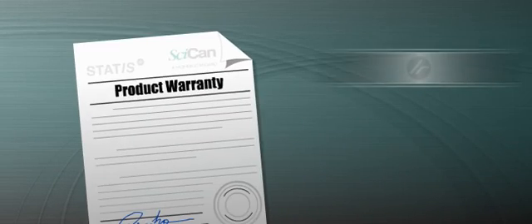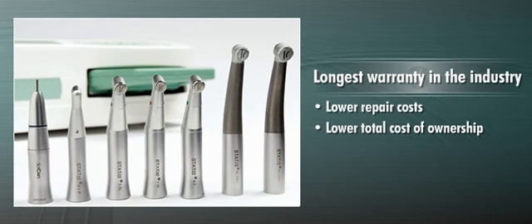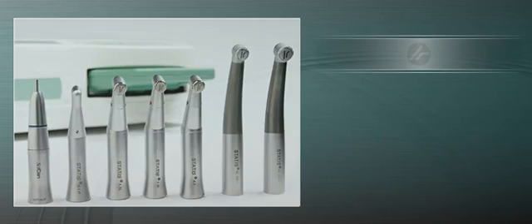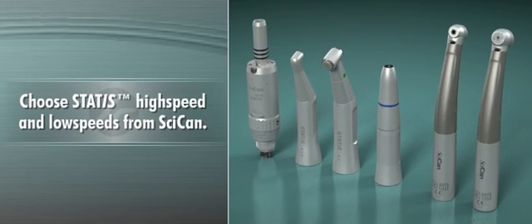And with the longest warranty in the industry, you get lower repair costs, a lower total cost of ownership, and the peace of mind that comes from knowing your most important instruments are guaranteed for three full years. For state-of-the-art handpieces that are built without compromise, choose STATIS high-speed and low-speeds from SciCan.